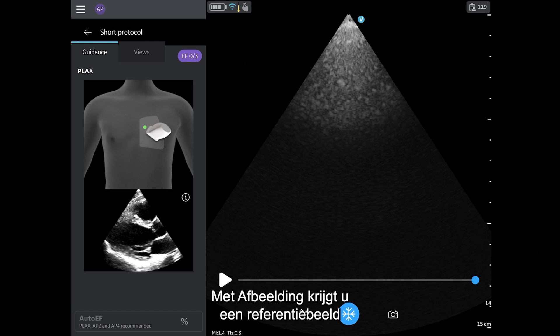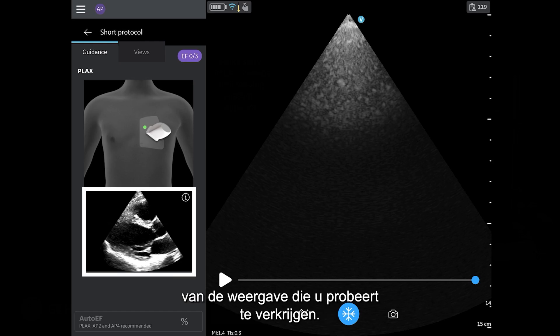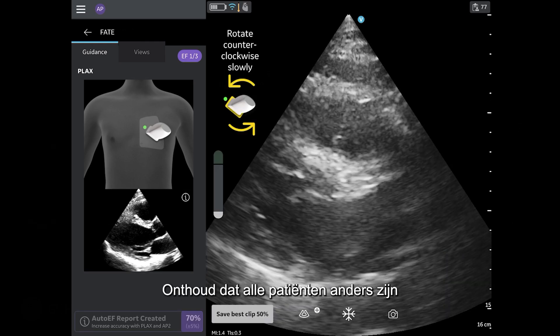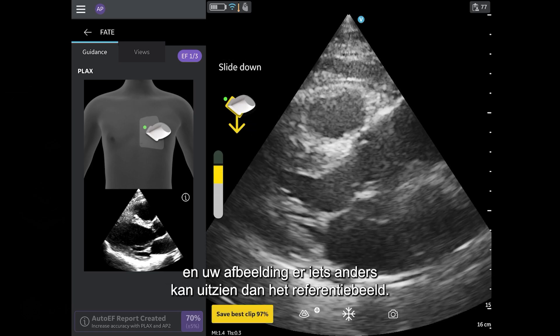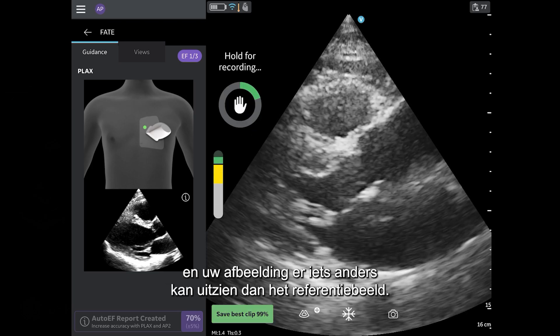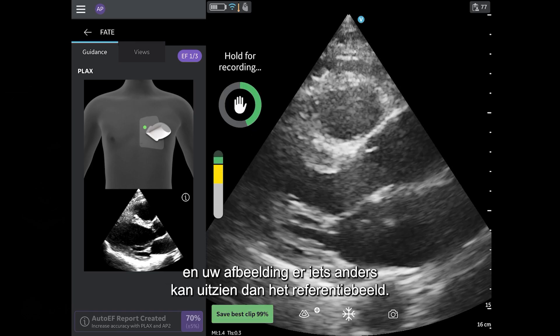Picture provides you with a reference image of the view you are trying to acquire. Remember that all patients are different, and your image may look a little different than the reference image.